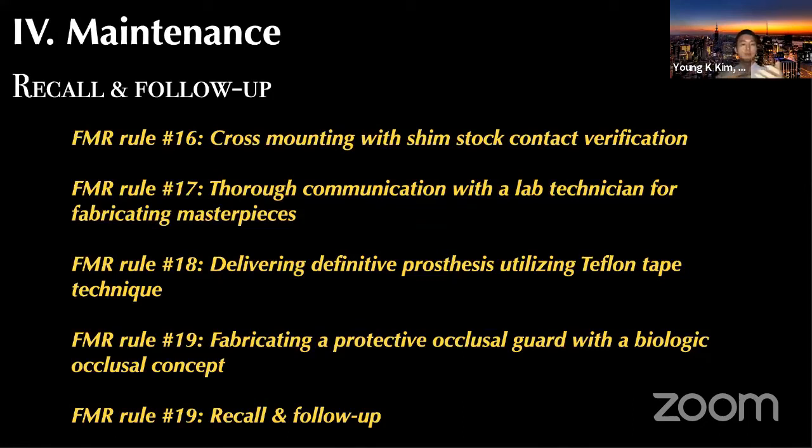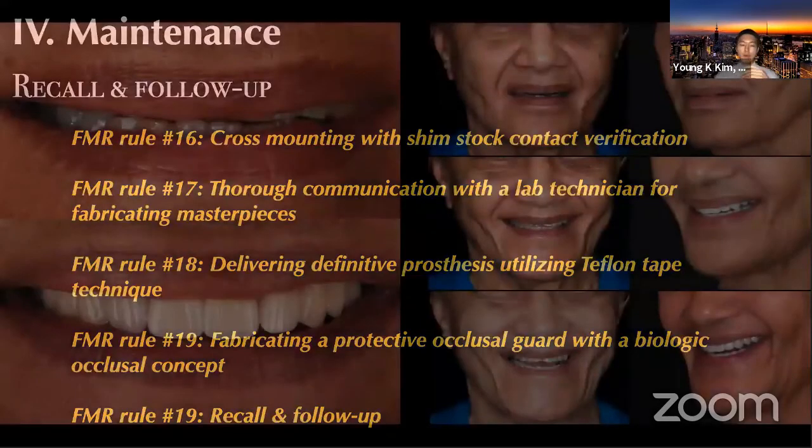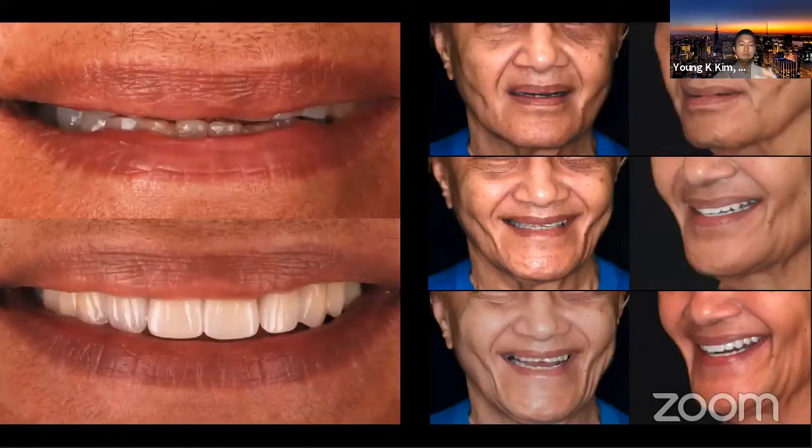Number 18 would be delivering definitive prostheses using the Teflon tape technique. And 19 will be fabricating a protective occlusal guard with a biological occlusal concept, followed by the recall and follow-up. So in full mouth rehabilitation, it's critical to attain not only the foundational knowledge, but also clinical skills to provide a smooth treatment flow to the patient who's about to go through a life-changing experience.